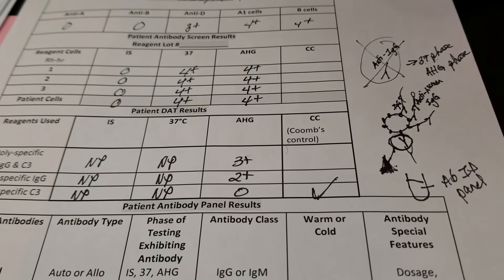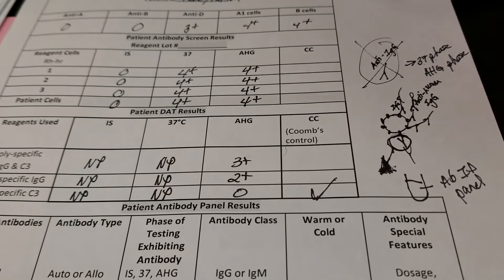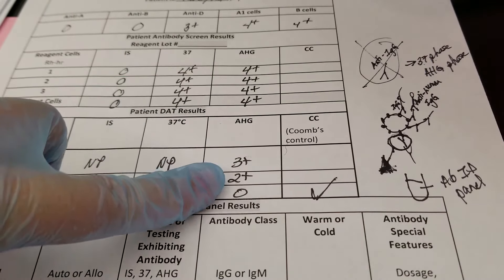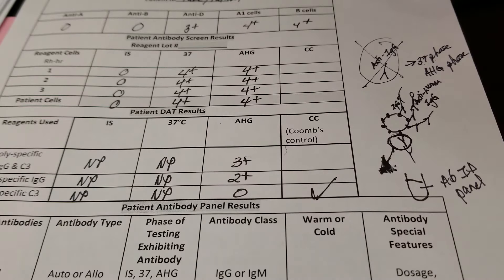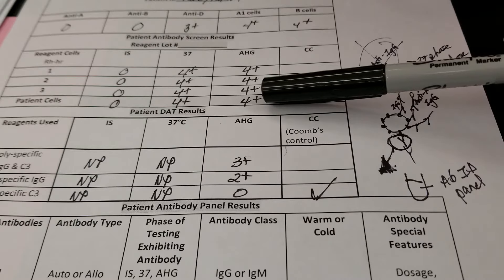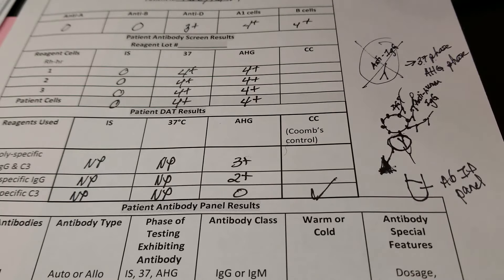Today we're going to be doing an acid elution because we had a patient that had a positive DAT. They had an autoantibody in the antibody screen. We did a DAT and found out that it was anti-IgG that was causing the sensitization of the red cells. Since we know that the patient's red cells were sensitized with an IgG antibody, we are trying to pull that antibody off and put it into what is called the eluate and test it — it's a liquid solution.